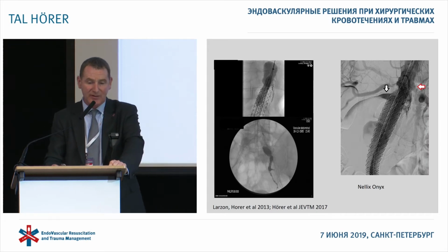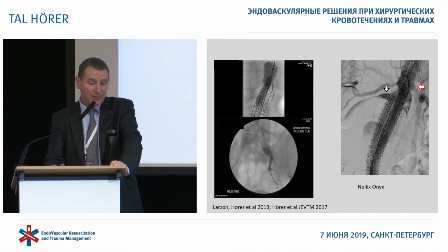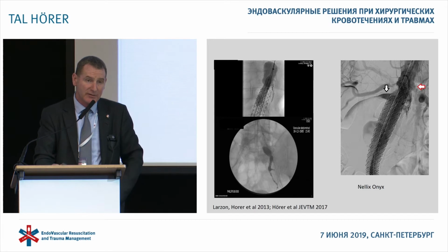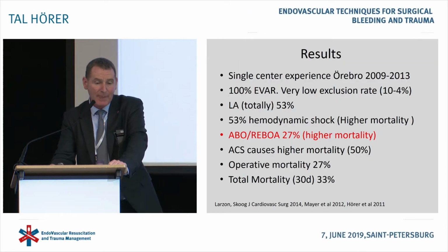These are some more examples. One of them is a very exciting Nellix graft that is now out of the market, but the patients are going around with endoleaks. You can solve it in different ways, and this is an important tool.